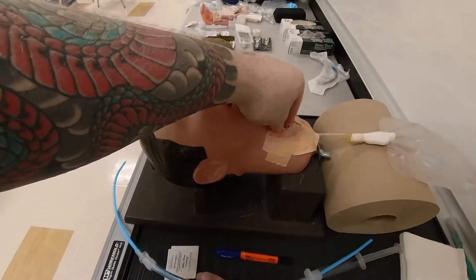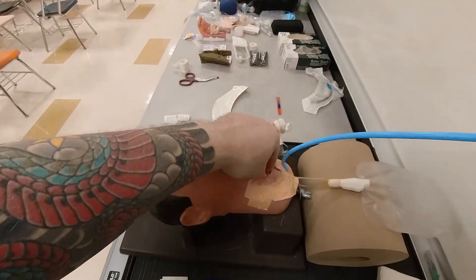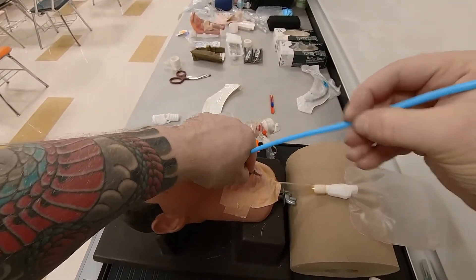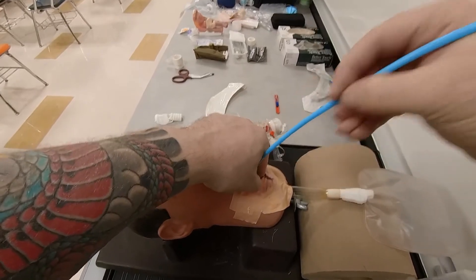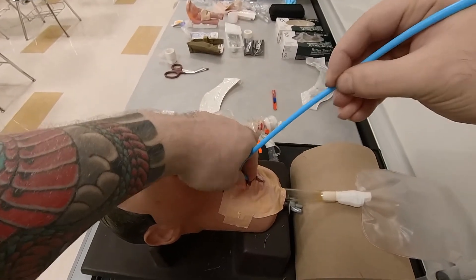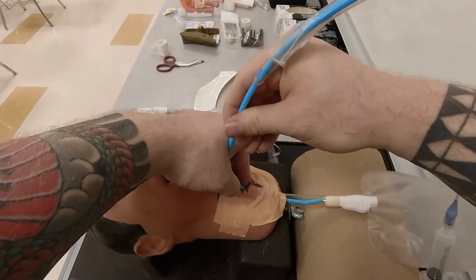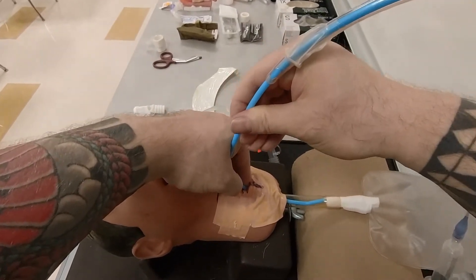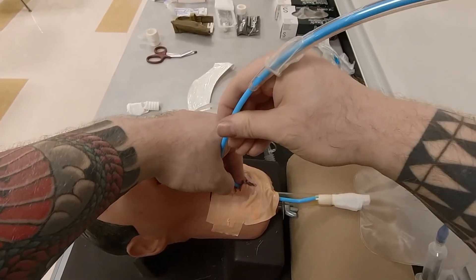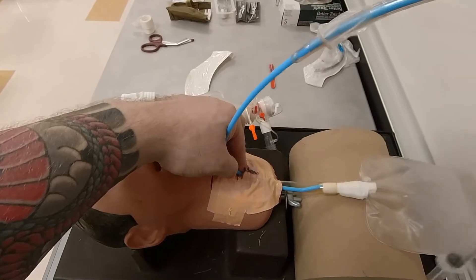The next step is to take your preloaded gum bougie and go in along the back of your finger, feeling the Coude tip. This is the Coude tip going past the fat pad on your index finger. Once it goes past, you can feel for holdup in the distal airways. Don't go too forcefully, as you could cause bleeding. I have holdup.